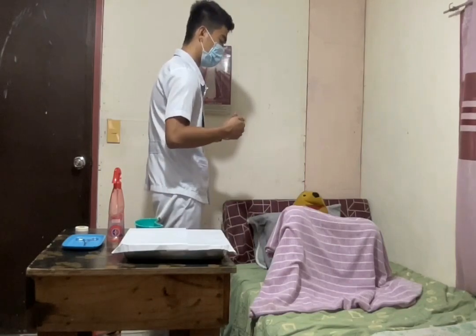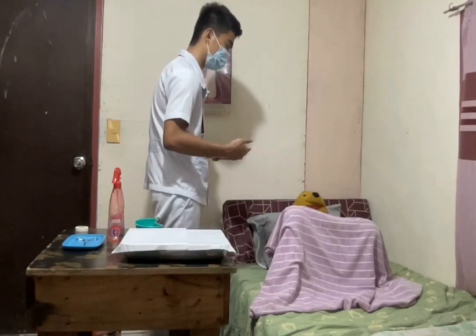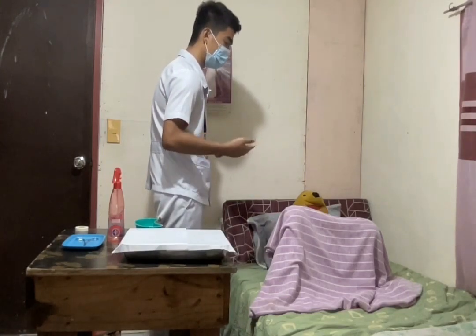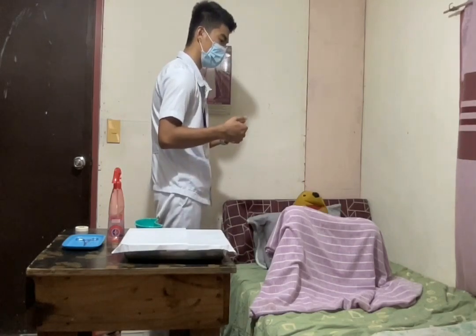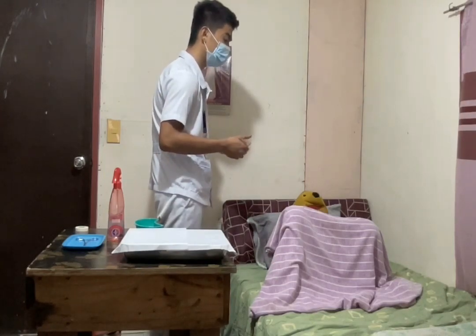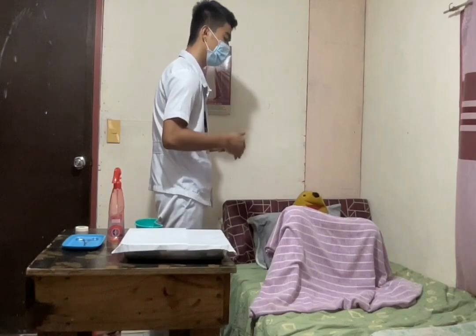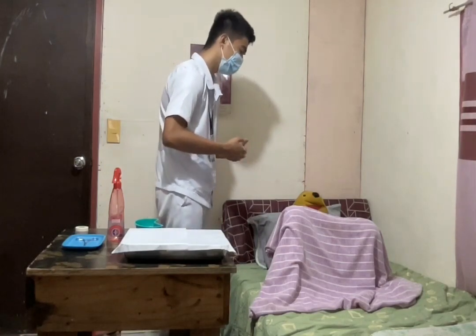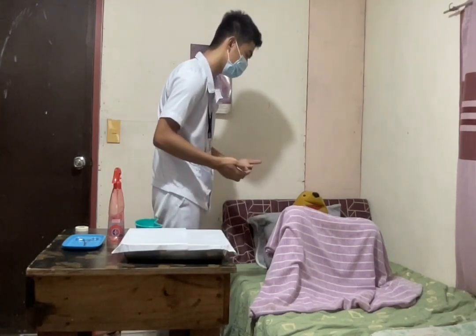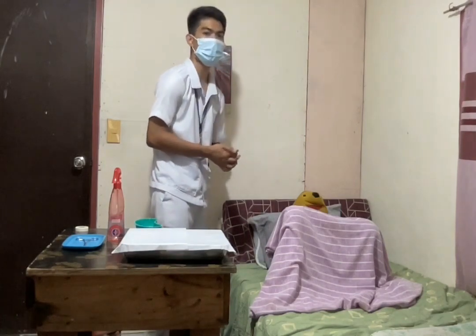Ma'am, today I'll be explaining the procedure that we'll be doing with you. We'll be doing the catheterization. This allows you to urinate since you cannot urinate properly. We're going to add a tube in your urethral opening. It allows you to empty the urine in your urinary bladder. Ma'am, before we proceed, do you have any clarifications or questions before we proceed with the procedure? Okay, thank you.